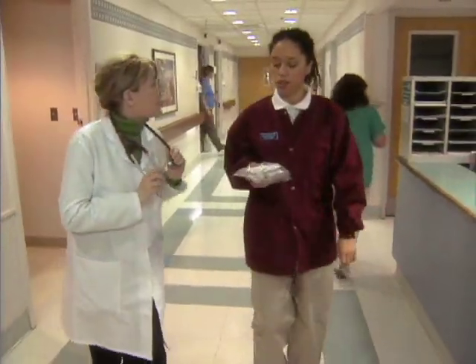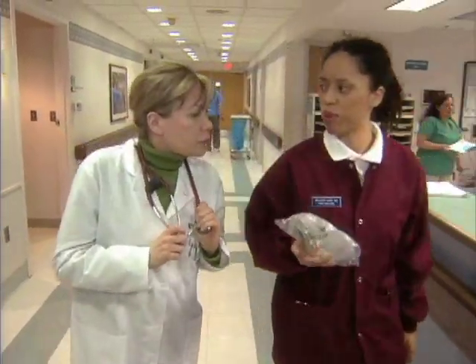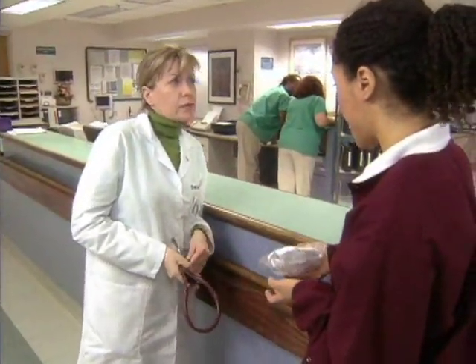I was just looking for you. Can you help me apply a partial rebreather mask? Of course. What's the situation? Well, my patient has had some changes in his respiratory status, and his oxygen saturation has dropped to 89%. So his nurse called the doctor, who ordered a mask with an oxygen flow rate of 10 liters per minute.